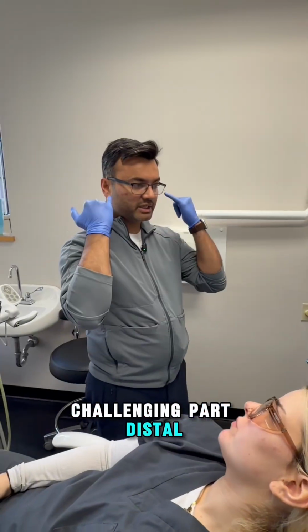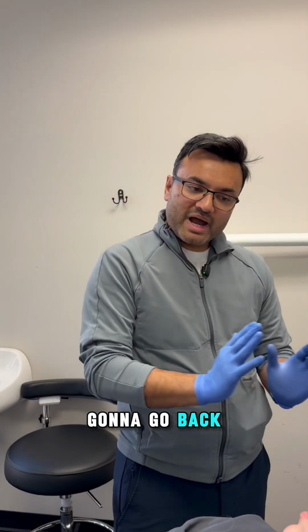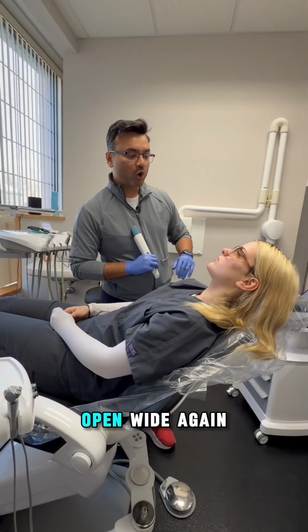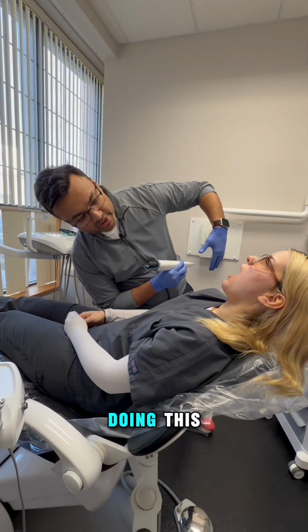Challenging part, distal of upper second molars. So again, we're gonna go back, step back a little bit. Let's look at chair position now. Think about this position the patient is. Open wide. Again, I can't see. Why am I doing this?